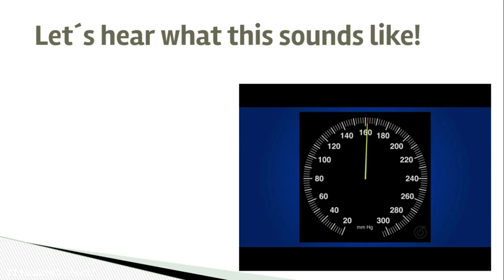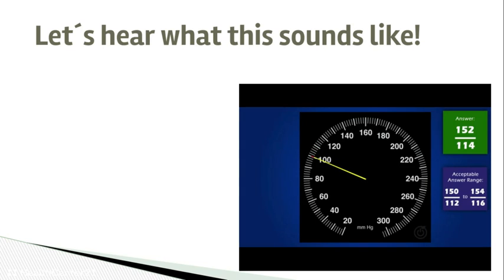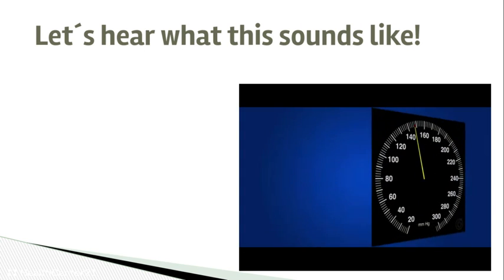Try another. So that one is quite high. Let's try one more.